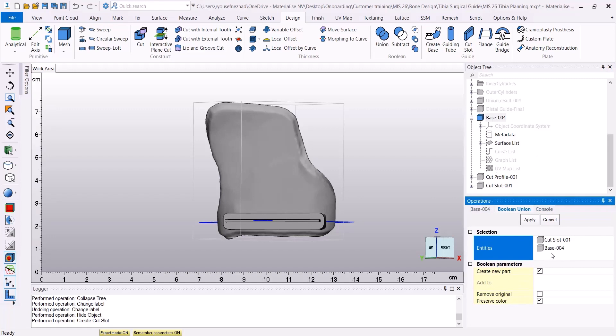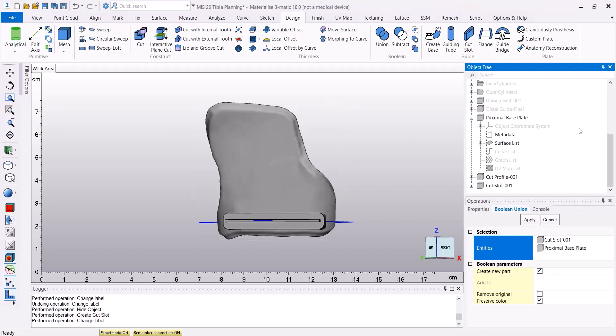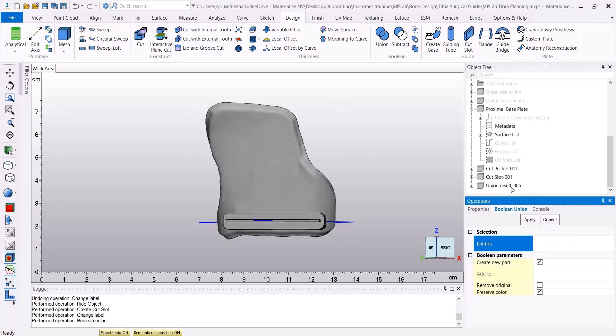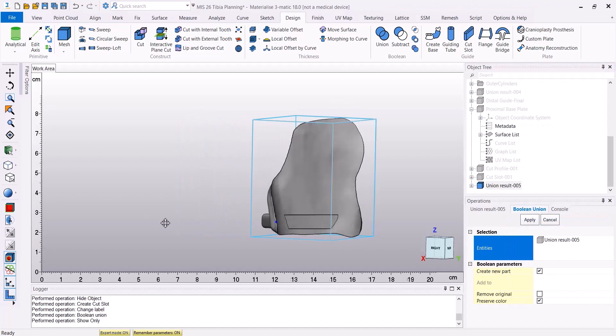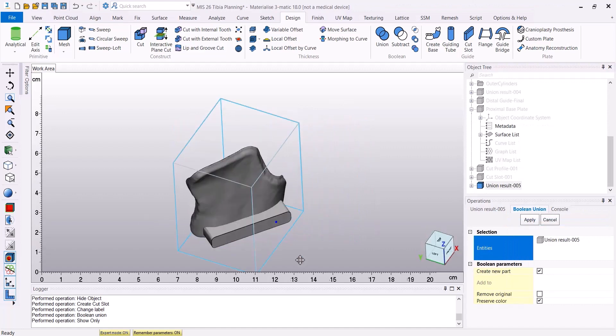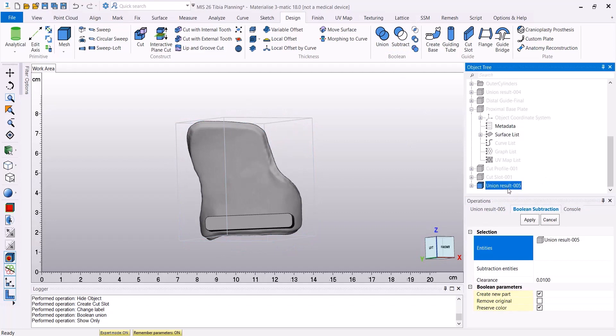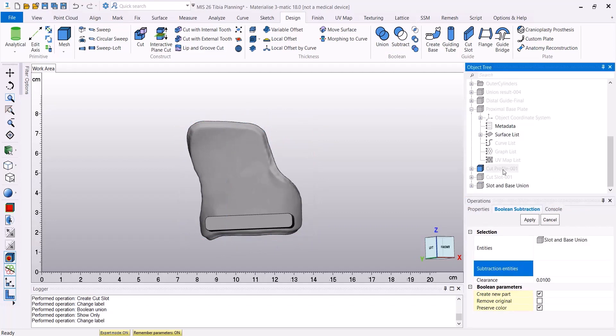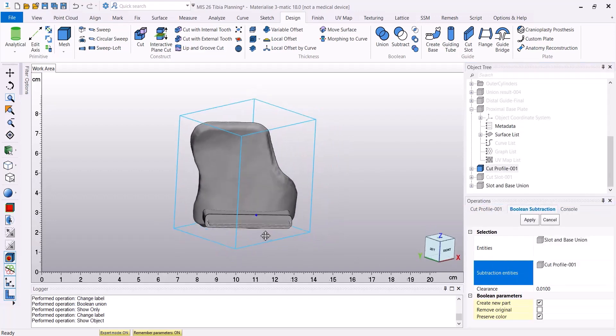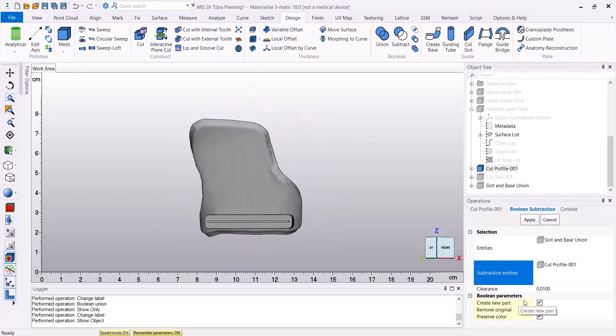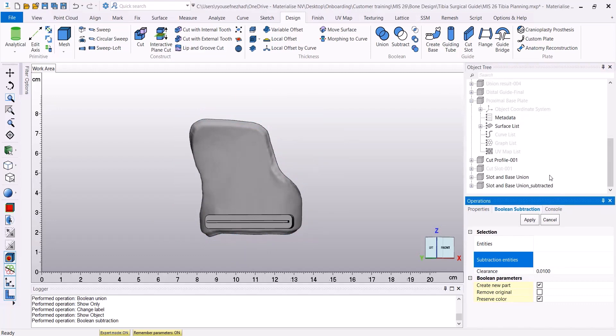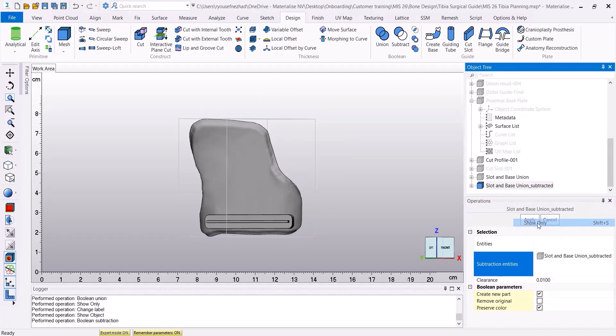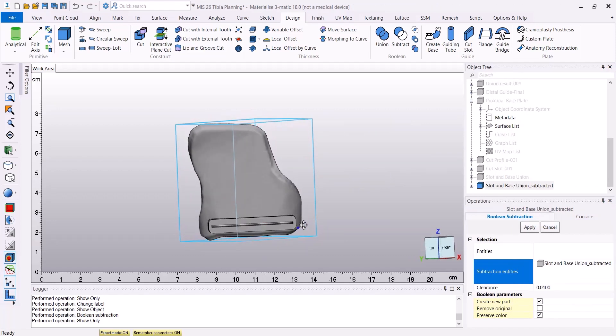In the next step, I'm going to use the boolean union to connect my base with the cut slot that I have created. And then I'm going to subtract the cut profile from my base. And then I will have the final result in my object tree.